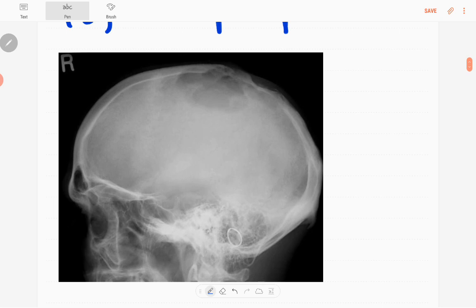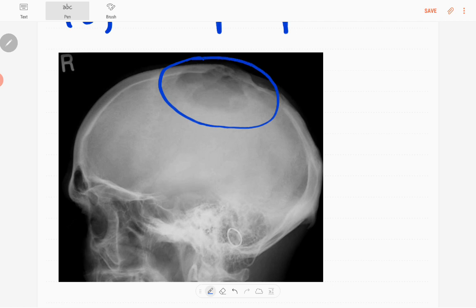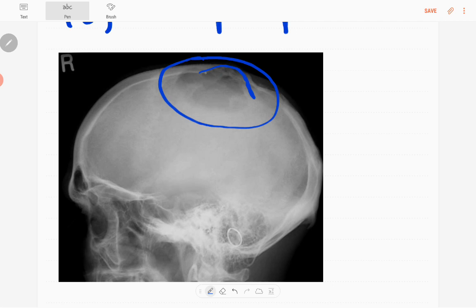Here you can see there's a geographic type of lytic lesion in the parietal bone. It has well-defined margins, some expansion of the bone is seen in this region, and cortical breach is seen with thinning.